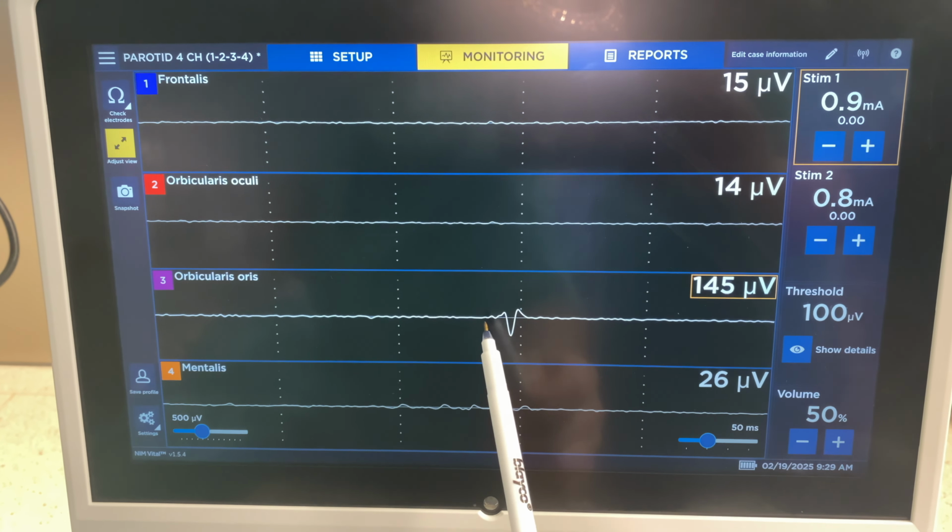Now, the first thing, put it up now to 1.5. 1.5 is a good enough level. It's about 3 or 4 times what I would expect a raw nerve at this location to get. So the first thing I'm going to do, I'm just going to look here, and I'm going to show you a couple of things that are commonly mistaken for the nerve. This. Now, did you hear that? I'm going to do this again. Did you hear the beep, right? Listen.